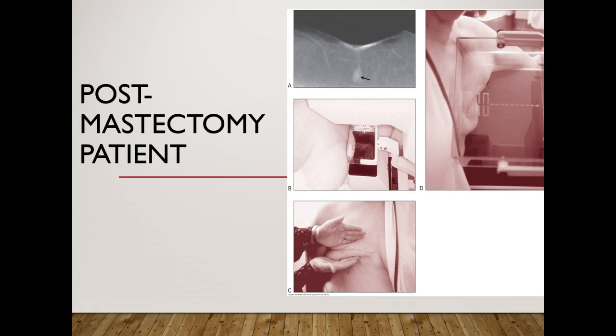This slide here shows imaging that was done on a post-mastectomy patient. Not all facilities are going to require this. They would probably do it if it's requested by the ordering physician, or some facilities may have this as part of their protocol.